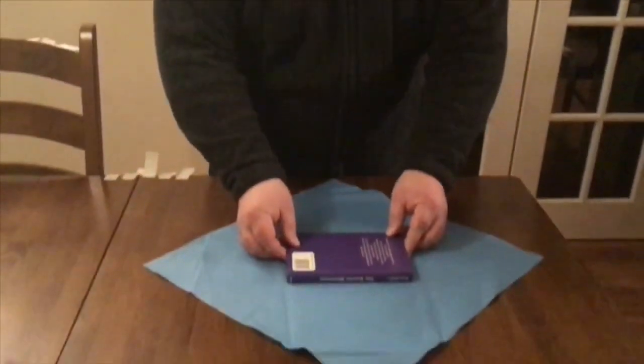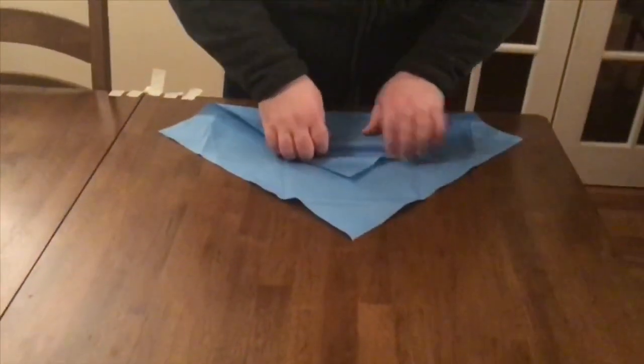Hello, my name is Steven. Today I'm going to show you the envelope wrapping technique. Work on a flat, smooth surface in a well-lit, clean room.